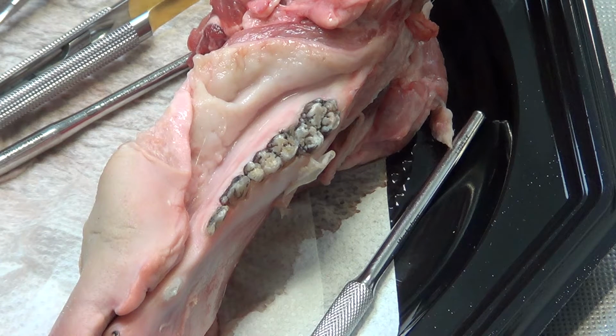You go deeply for 4-5 millimeters. It depends on what you have obtained from the palate. This is split elevation of the flap.